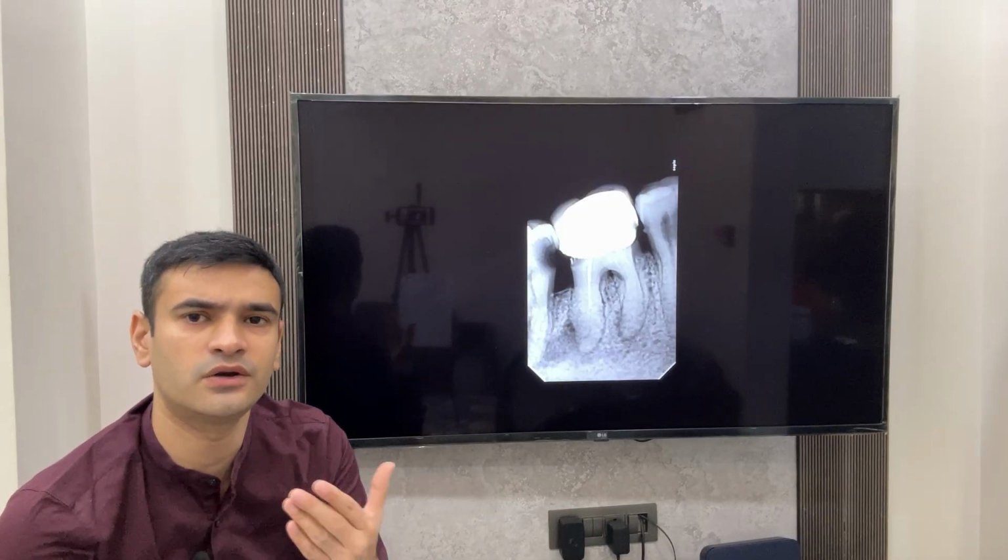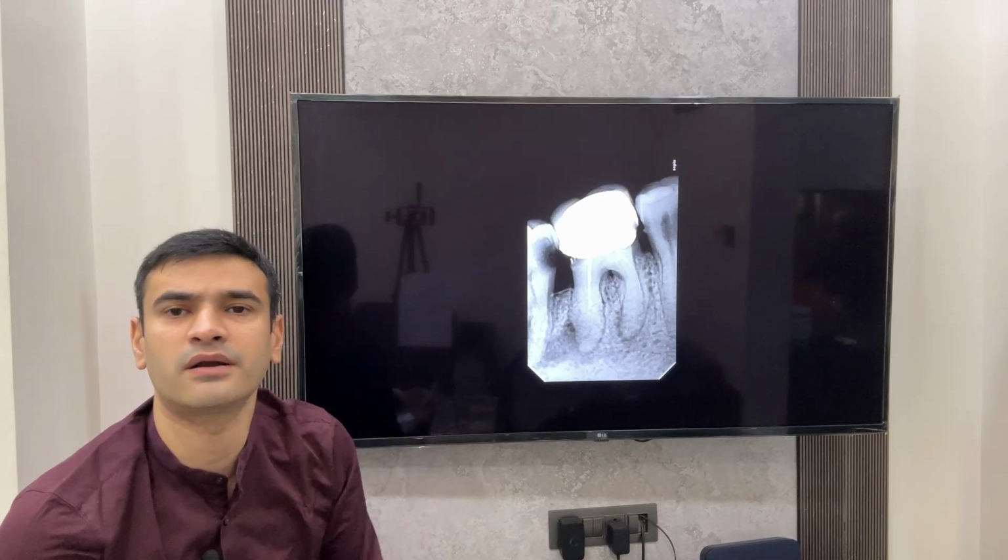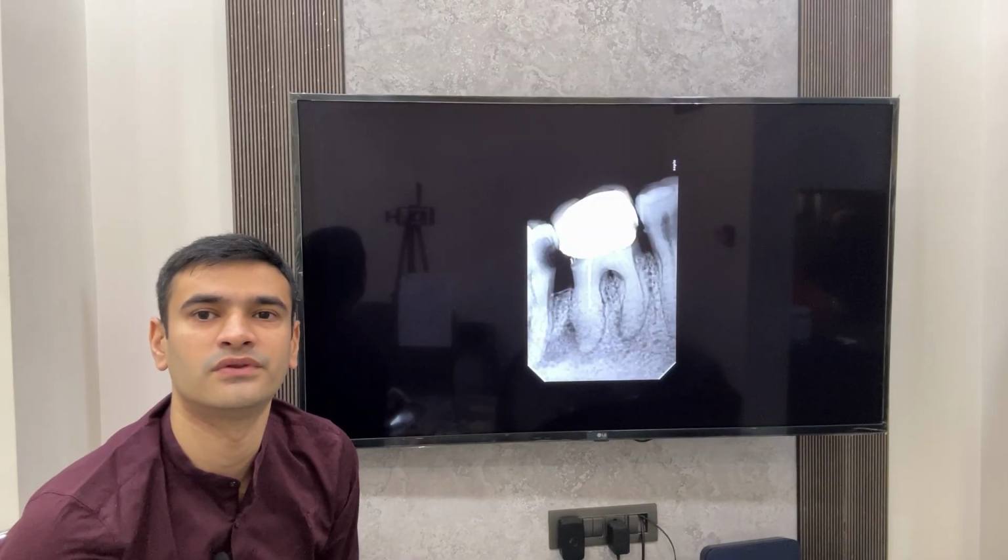In the second part of the video, I'll try to demonstrate how we can remove gutta-percha and what are the things that you should follow while you are planning to remove the gutta-percha from inside the canals.